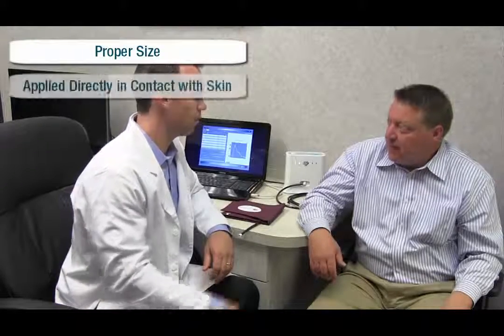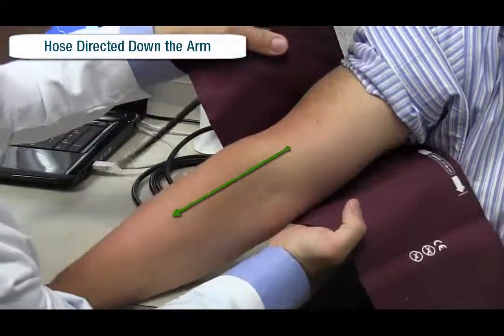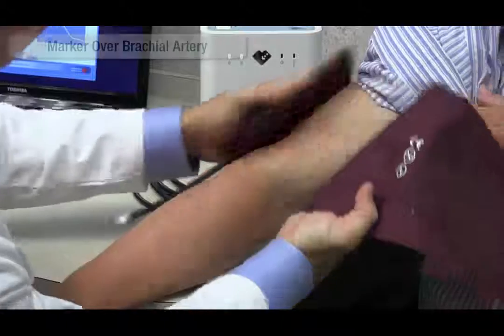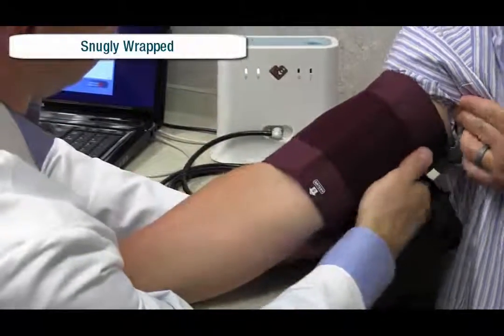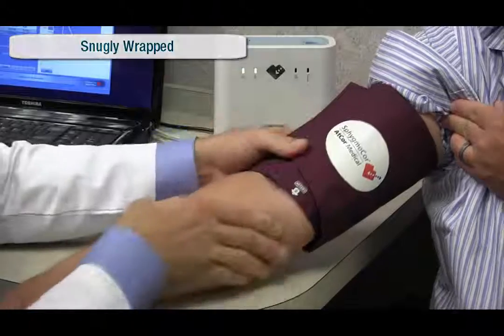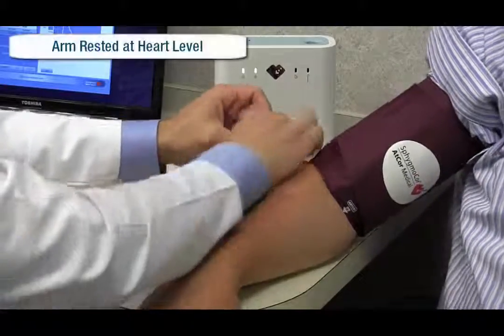Place the appropriately sized cuff on the patient's arm, directly in contact with the skin, with the hose directed down the arm. As the cuff is wrapped around the arm, ensure that the index marker falls within the defined range and that the artery marker is over the brachial artery. The cuff should be snug but not overly tight. It should be possible to fit 2 fingers between the cuff and the patient's arm. The patient should have their arm comfortably rested on the table or bed at the level of the heart.